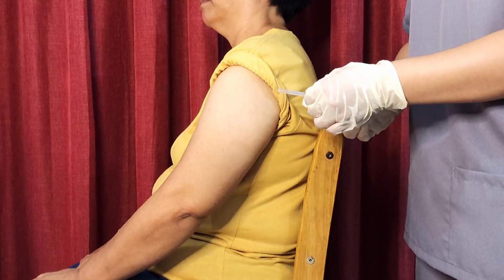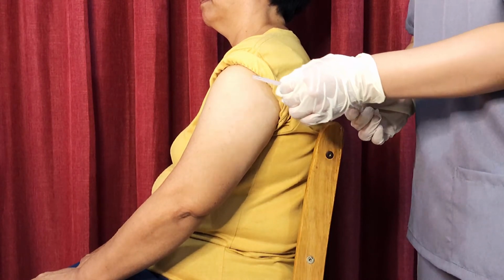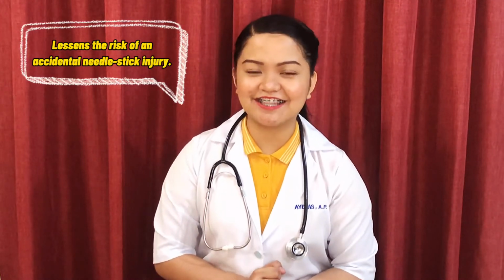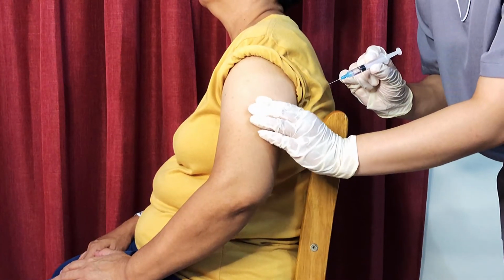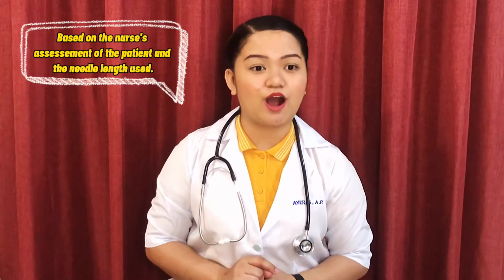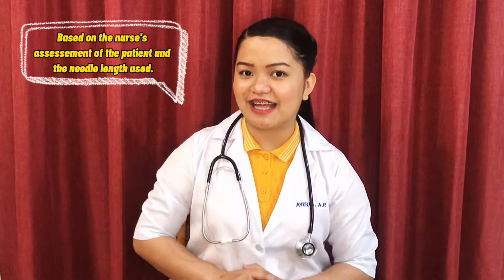Remove the needle cap with the non-dominant hand, pulling it straight off. This technique lessens the risk of an accidental needle stick injury. And then, grasp or pinch the area surrounding the injection site. The decision to create a skin fold is based on the nurse's assessment of the patient and the needle length used. Pinching is advised for thinner patients.